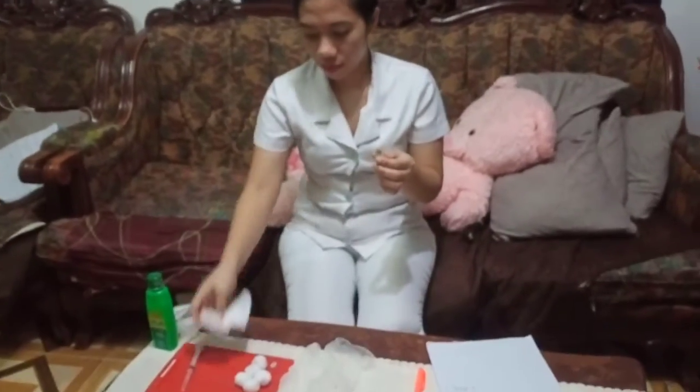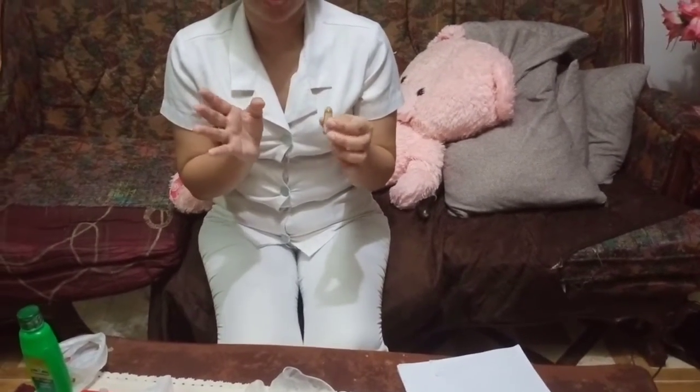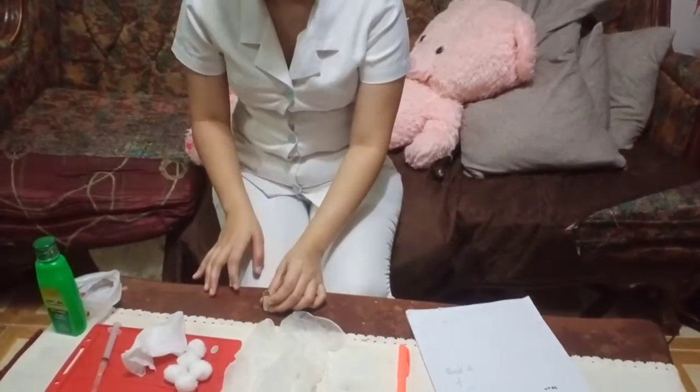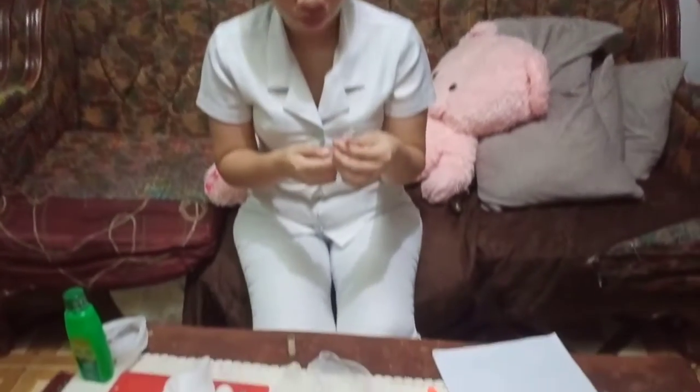So first we have to clean the ampule. Then dispose the top of the ampule in the sharps container. Then now we're going to withdraw the medication. So place the ampule on a flat surface. Then attach the filter needle to the syringe.